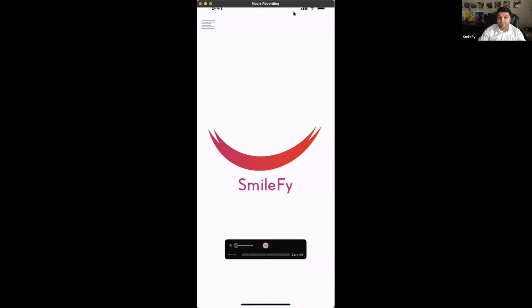2 o'clock session. It's Wednesday, and I'm going to show you today something different. I'm going to show you today something crazy, and it's going to be super interesting.